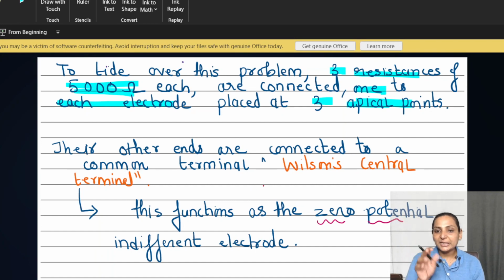So in this way you generated an indifferent electrode, so that every time you are picking up the activity, you are only going to pick up the activity of the active, exploring or unipolar lead. So what is unipolar? It is the lead. How is it generated? It is the active minus the indifferent electrode. What is bipolar? Negative and positive terminals.